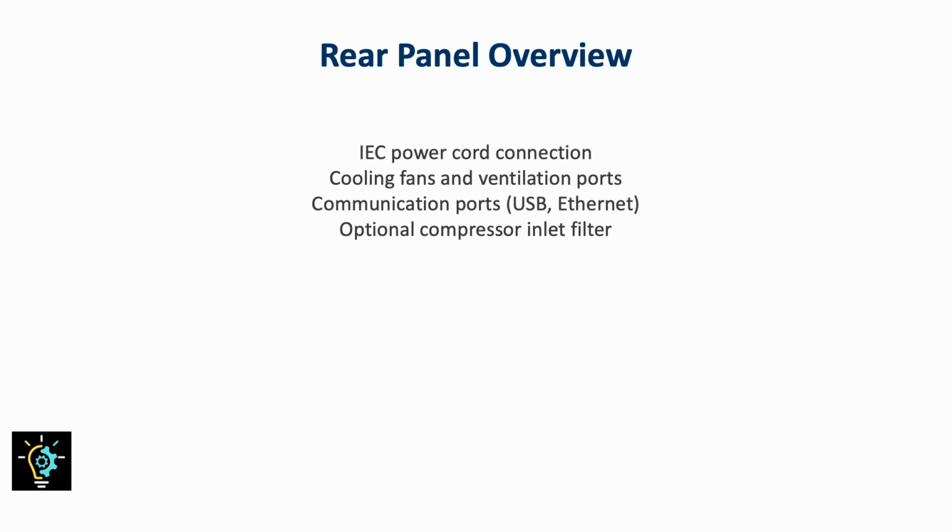In some configurations, you'll notice an optional compressor inlet filter, depending on how the hospital has set up its gas supply. In practice, the rear panel is your technical hub. It's the side you'll use most when performing service work, because it links the ventilator to its power, its cooling system, and its broader hospital network.